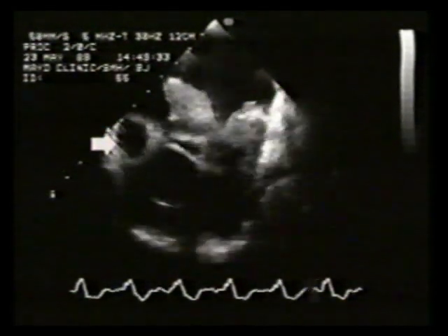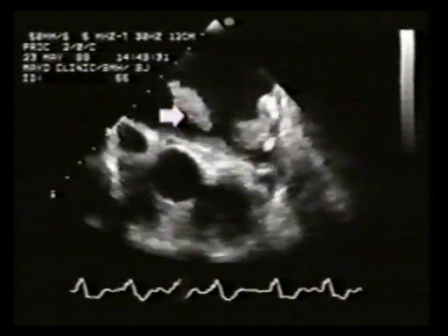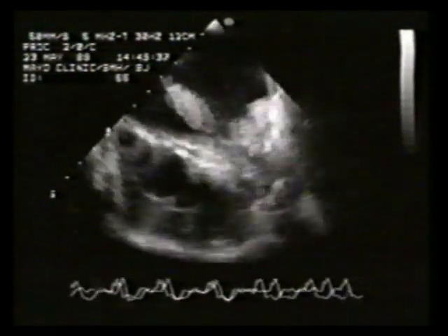In this basal short-axis view, the superior vena cava, aorta, and pulmonary artery are visualized. Within the left atrium and the left atrial appendage are multiple thrombi. These could not be visualized by precordial echo.